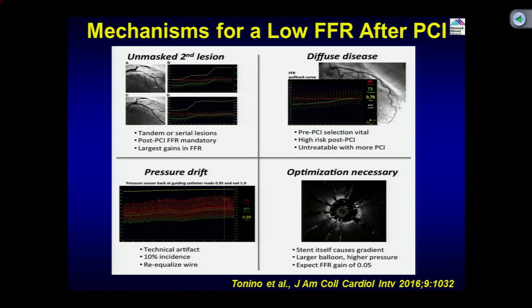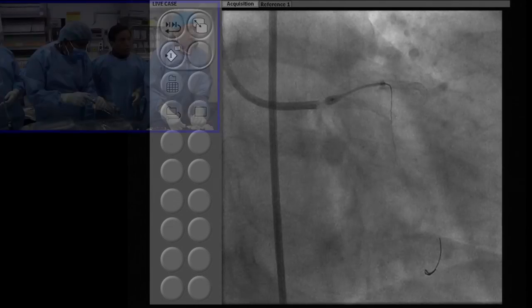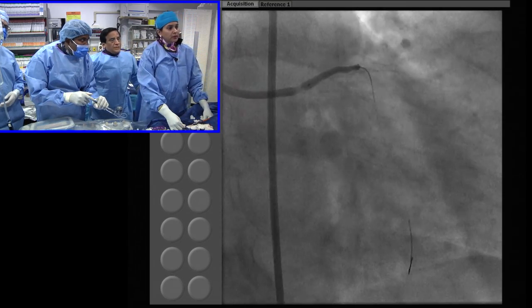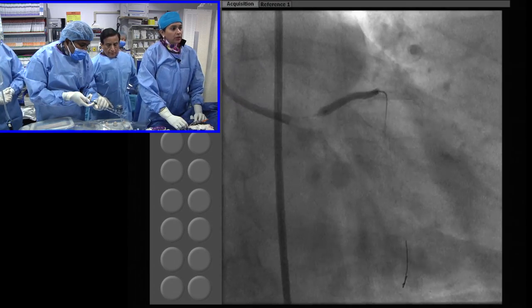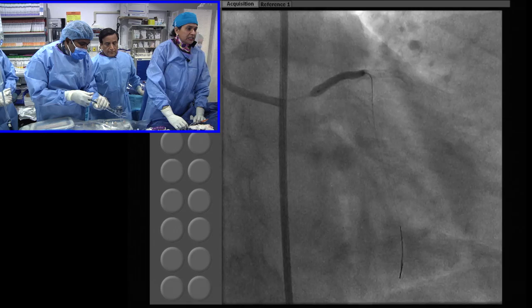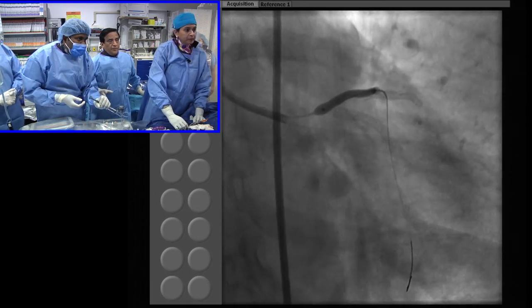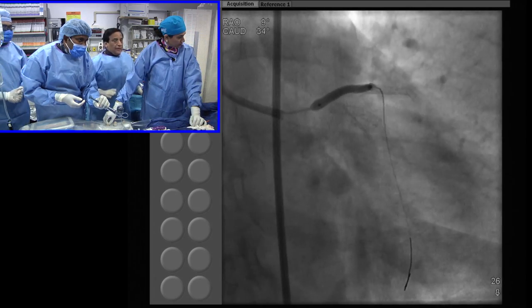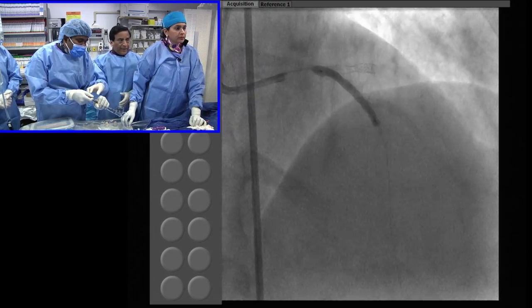So now Anu is ready here to do it. You're out of the ostium, good, okay. So slow inflation. Tell us what size you have. 3028. It's a 3028, 6, 8, 10, 12. See, now the distal is too big, I guess. Enough. So clearly, deploy the BVS at 12 atmospheres. Don't go higher. Why? Because you are going to post-dilate 100% anyway. So 12 atmospheres, go overall for 30 seconds.